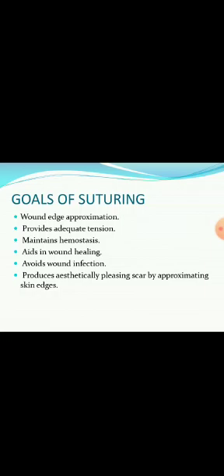The topic for today is sutures and suturing techniques. Now let's have a look at the goals of suturing. They provide wound edge approximation, provide adequate tension, maintain hemostasis, aid in wound healing, avoid wound infection, and produce aesthetically pleasing scars by approximating the skin edges.